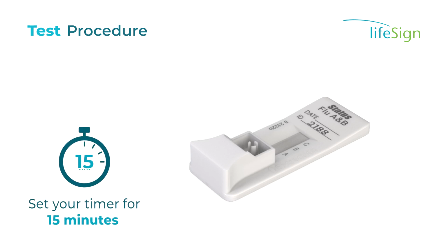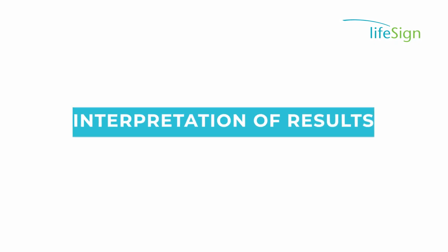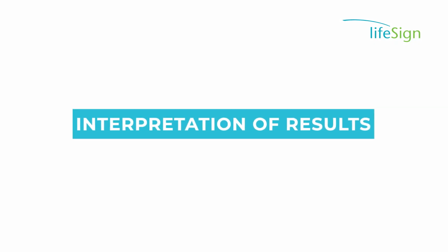A positive test can be read at 10 to 15 minutes or as soon as a pinkish-purple line appears in the control position and at the A or B line position on the test device. Negative test results must be confirmed at 15 minutes. Do not read the test after 15 minutes.